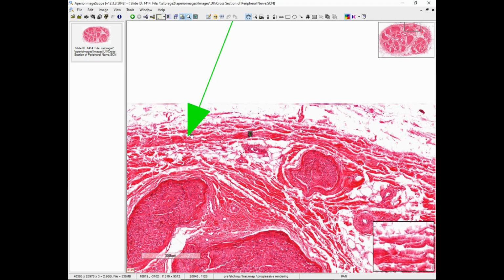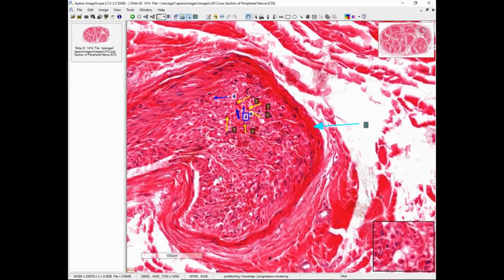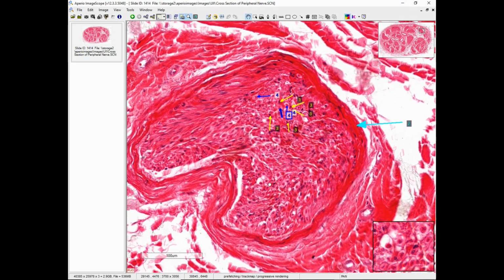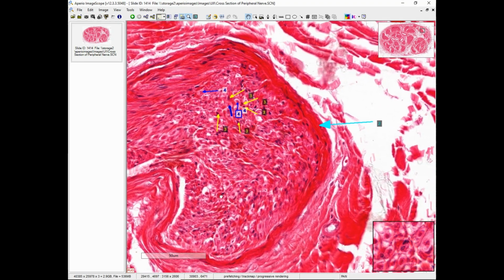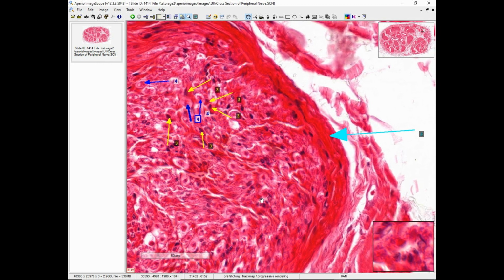Now one, see if you can identify it. That's the connective tissue surrounding the whole nerve. That's the epineurium. And I'll give you a moment here with these smaller scale structures. Try to zoom in, but not actually leave anything unseen. Take a second here.